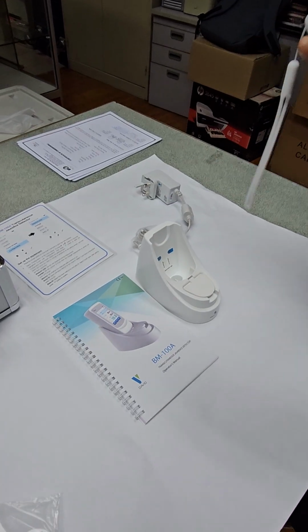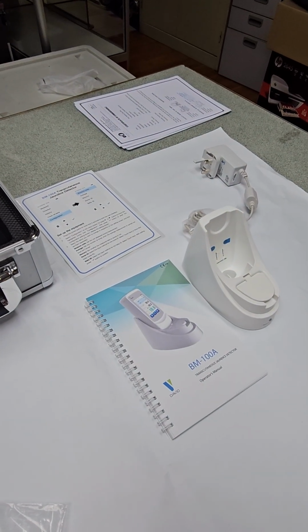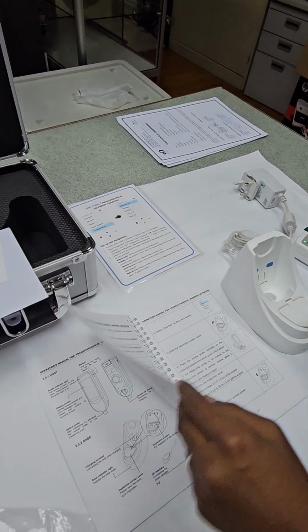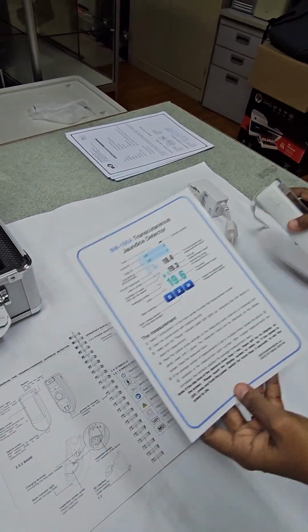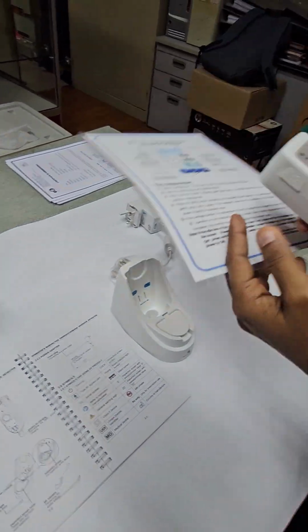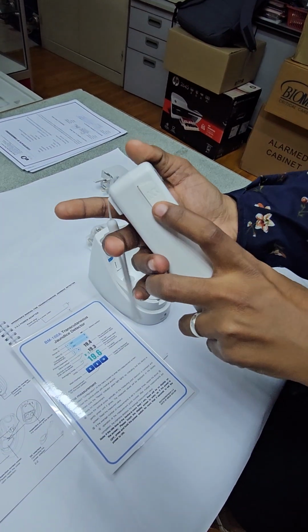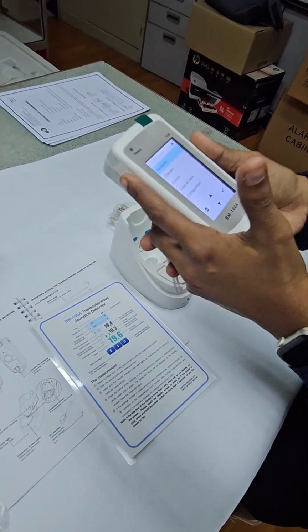Does it come together with a user manual? Yes, this is the user manual. The user manual also has the directions. Okay, wait, I'll show you. This is the on and off button. This is like a screen lock, standby.